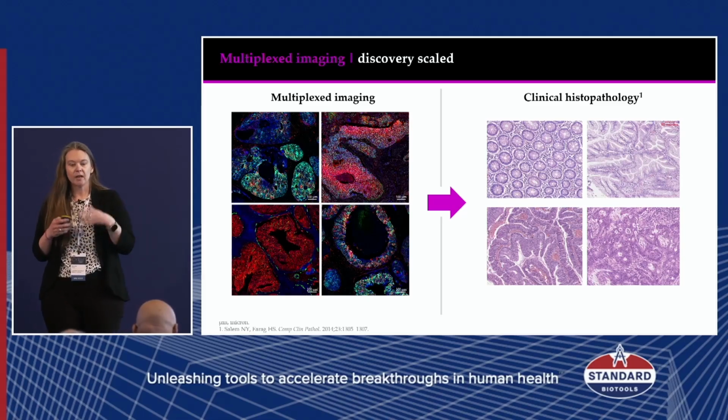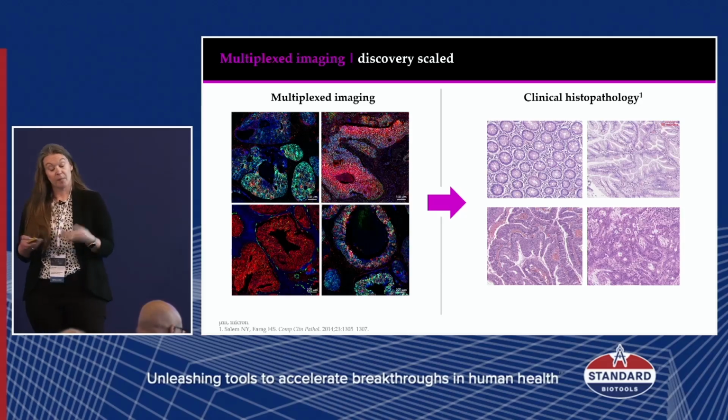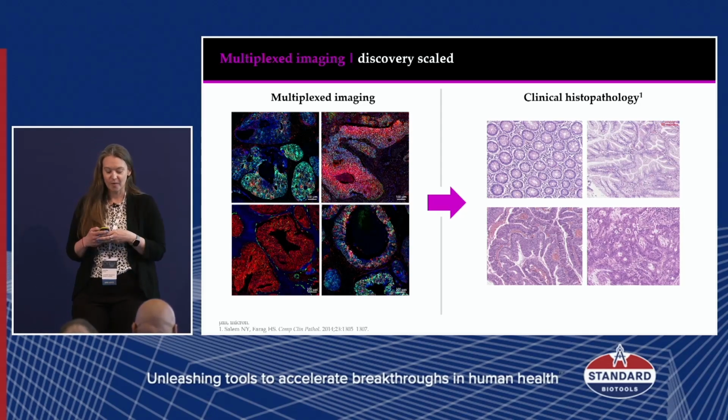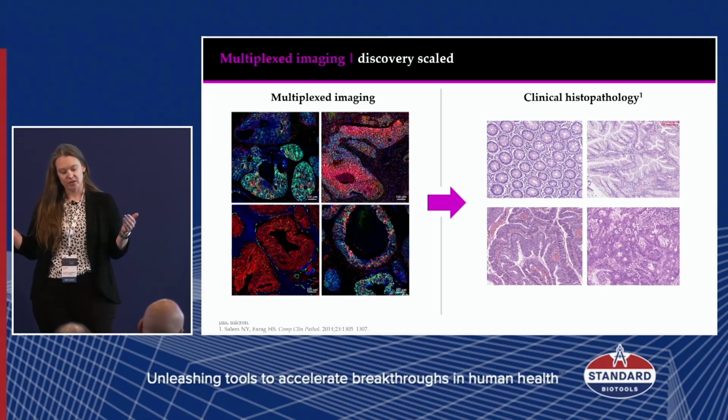And so the first thing that really became clear was that we don't have an autostainer. Chris mentioned earlier, if the robot's broken, use a PhD student. I'm not a PhD student, but this was the backup plan here, as there's no automated way of doing this. And so we realized that we were going to need to split this into batches.